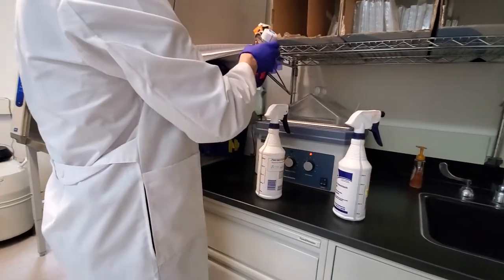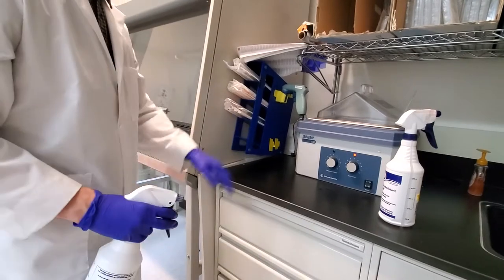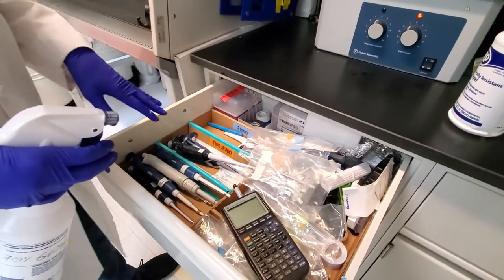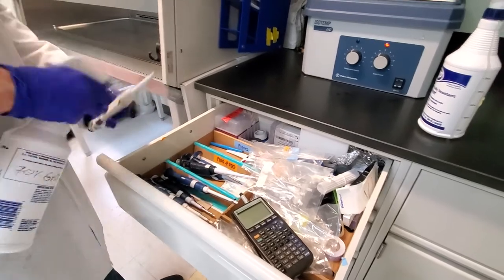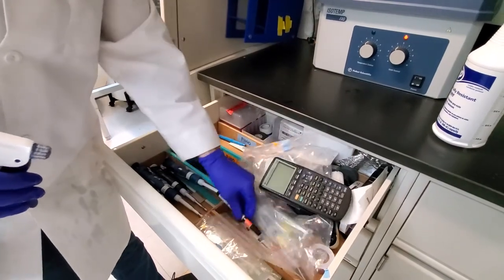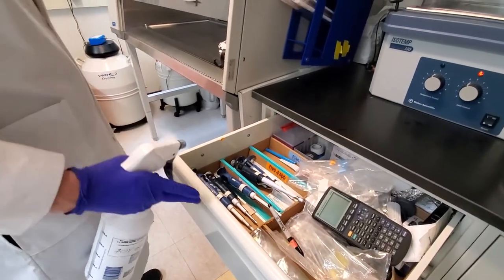This guy's pretty warm. Should be warm enough. Spray that down. There are a lot of different tools in here, instruments, everything like that. Pipettes. We try to keep separate pipettes for the tissue culture room so that we don't mix in with the outside. Spray that thing down. Some markers. This can be better organized, but it's not that well organized right now. Okay, so should be good for that.